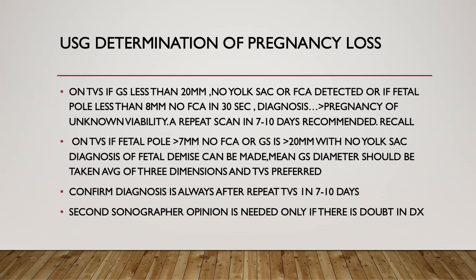A repeat scan should be done in 7 to 10 days, and it is recommended before making a diagnosis. Till that point the diagnosis is pregnancy of unknown viability.